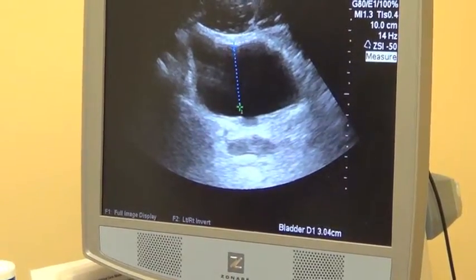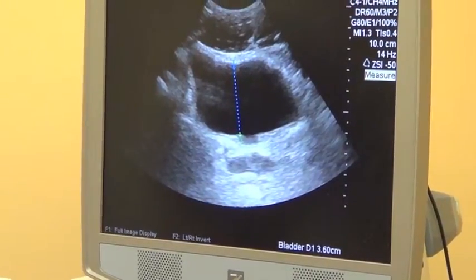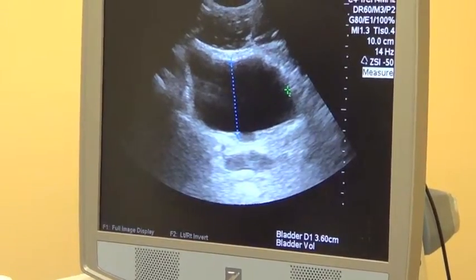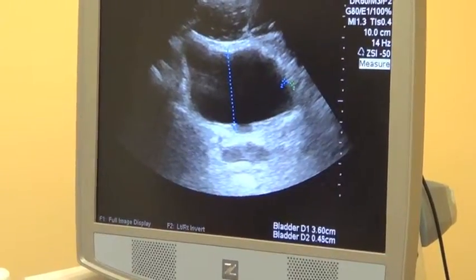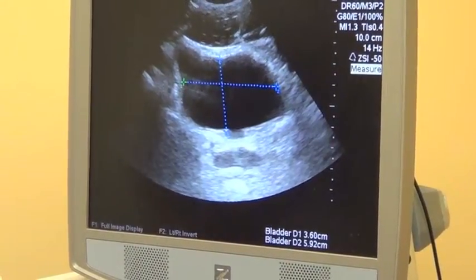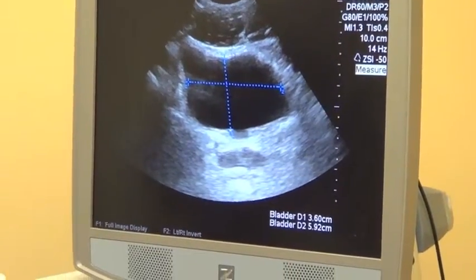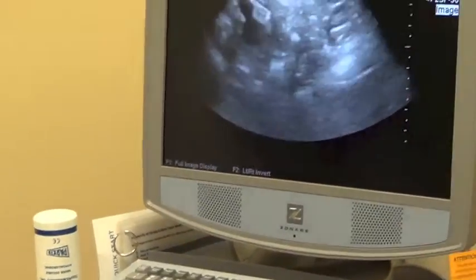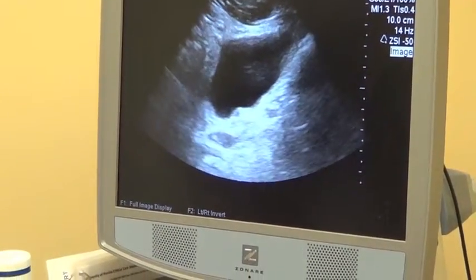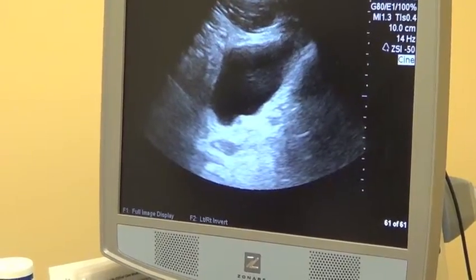We will first obtain our AP diameter and hit enter, then obtain our transverse diameter and again hit enter to put these values into the computer. At that point, we're going to unfreeze, switch back over to the sagittal plane, and freeze to obtain the final superior-to-inferior measurement.